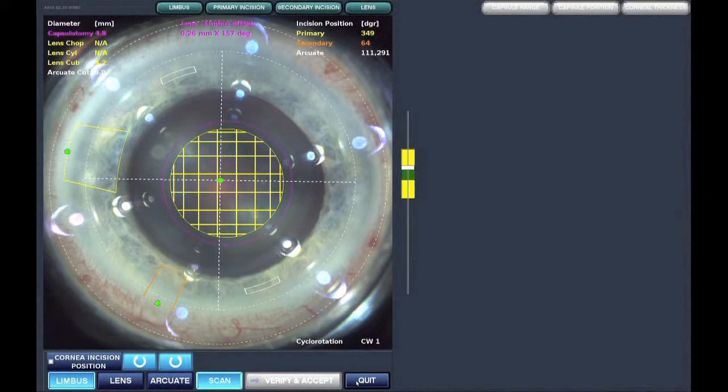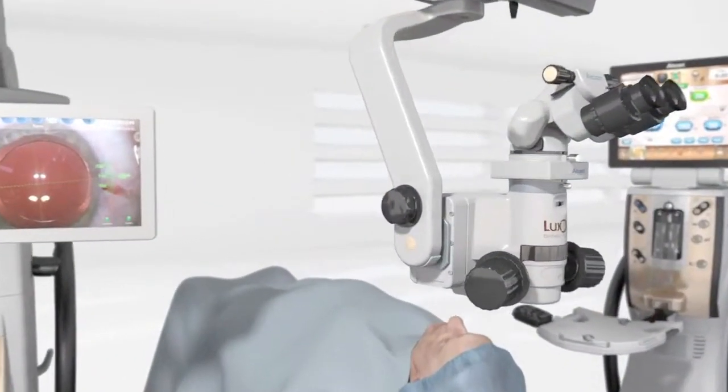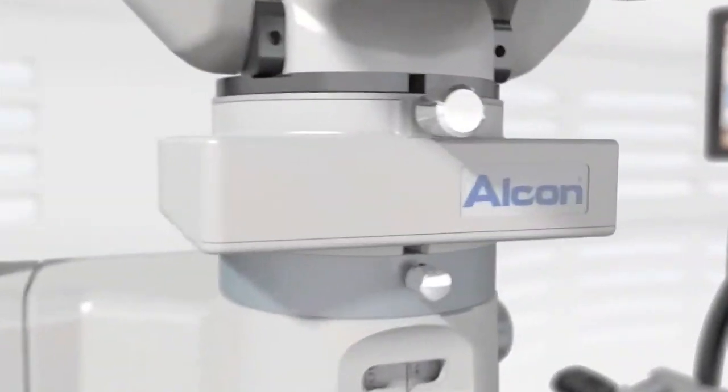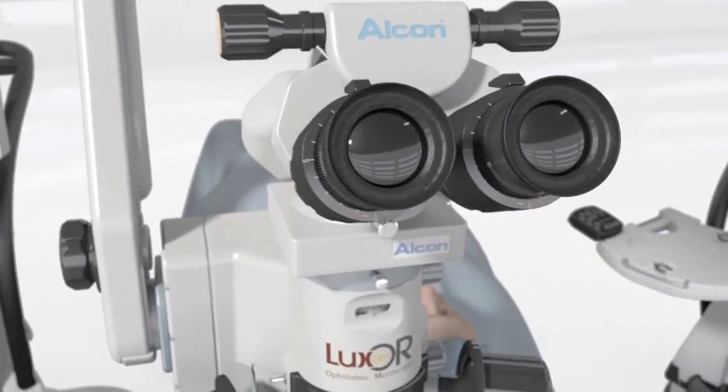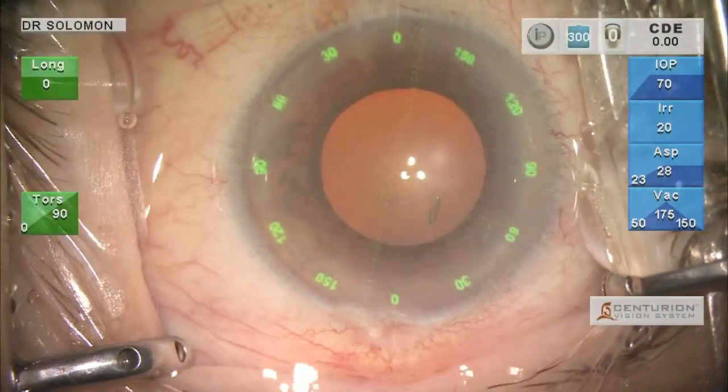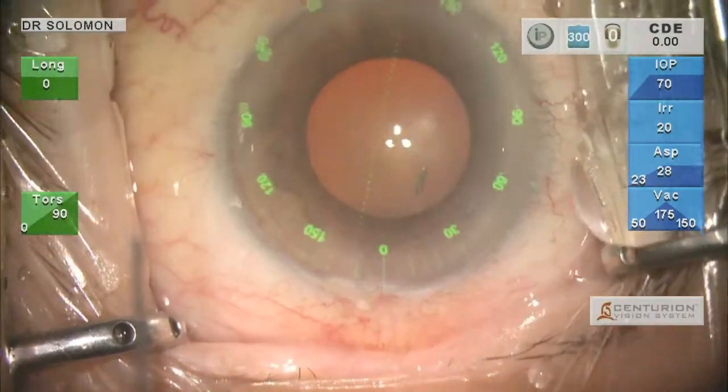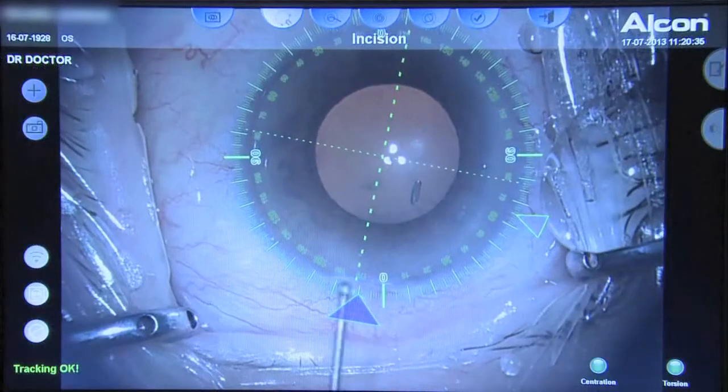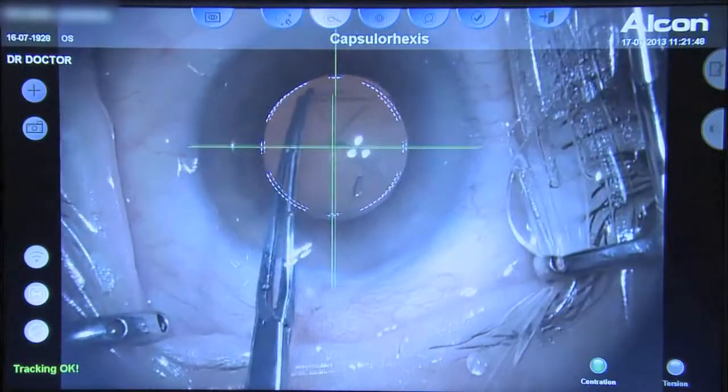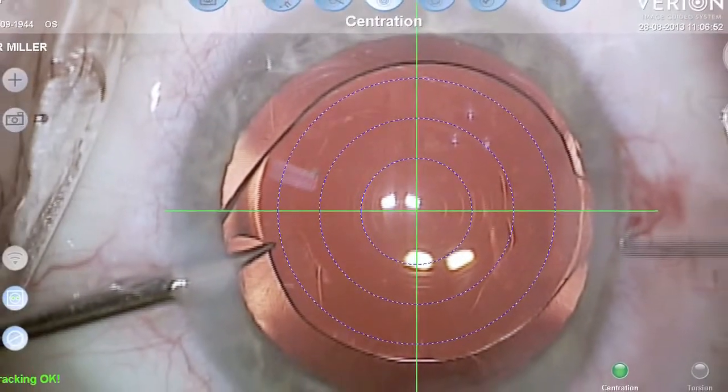Working in concert with a microscope integrated display, the Verion digital marker also provides real-time tracking overlays through the optics of a surgical microscope. These computer-generated overlays offer a new measure of consistency and control for every surgical step, including an incision guide, capsulorhexis guide, centration guide for multifocal IOL positioning, and toric alignment guide for lens positioning.